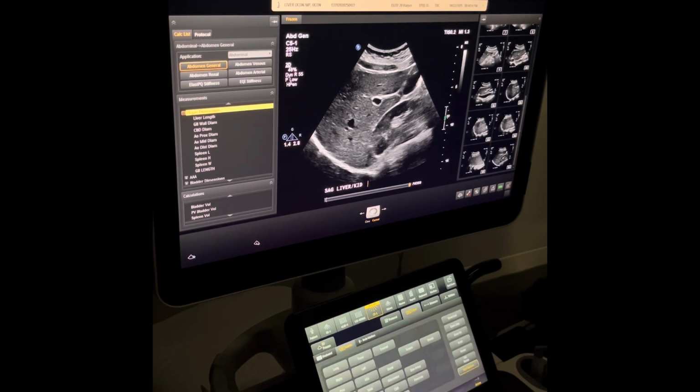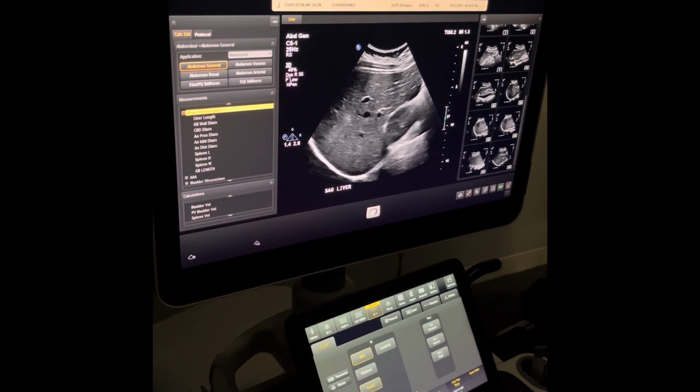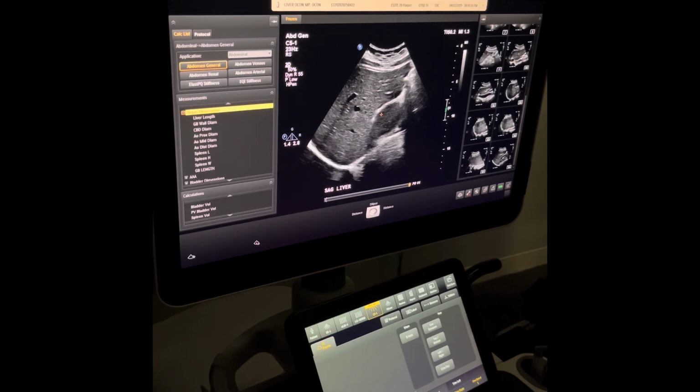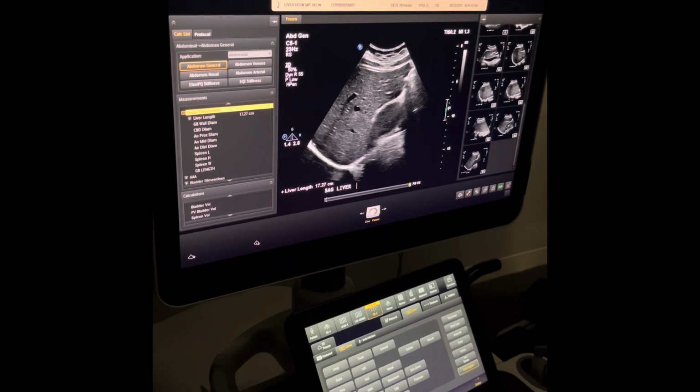And then I'm also going to be doing my liver measure. So this is a craniocaudal measure. You just want to make sure you're mid-clavicular, which I am right about here. So go ahead and breathe. I'm going to measure that as craniocaudally as I can. And I'm going to take one of those with and without measure. Next, I'm going to move on to my transverse sweep.